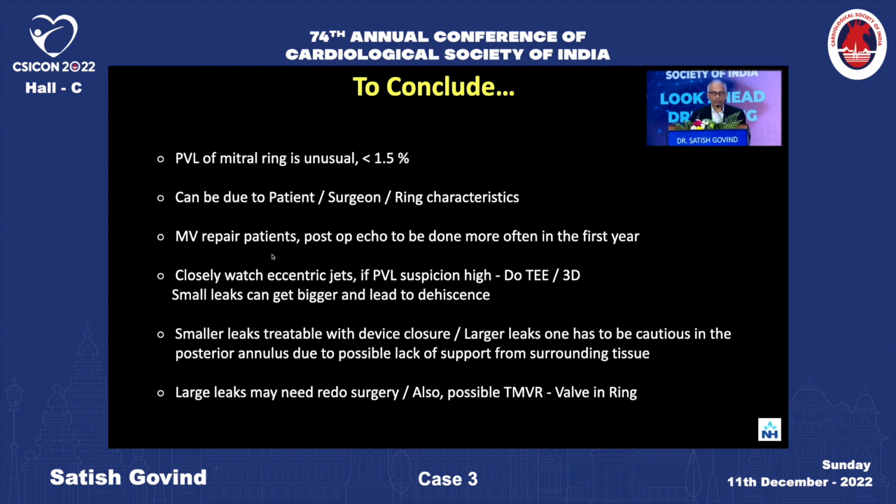What we need to do, as far as mitral valve repair patients are concerned, especially those who are at risk or vulnerable, is follow them a little more closely, at least for the first year, and after that it comes down. And if there is any sighting of eccentric jets, and if you feel that a paravalvular leak is there, if the suspicion is high, then it is better to do a TEE, and of course 3D can be very helpful.